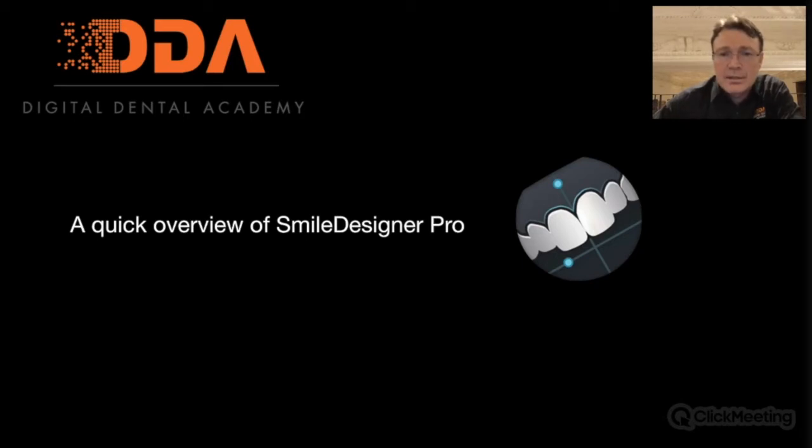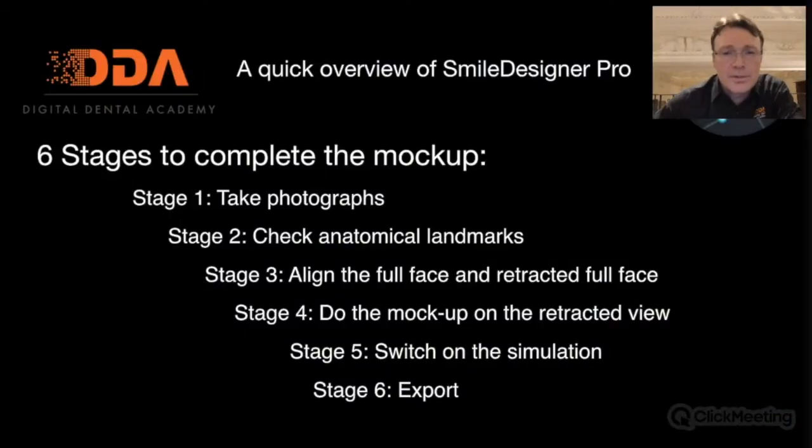So the overview of the software and what it does is it's basically 6 stages. The first stage is to take photographs, and for the photography, I'll talk tomorrow evening about photography and equipment and things like that. We've got a fairly standardized routine now for taking the photos.